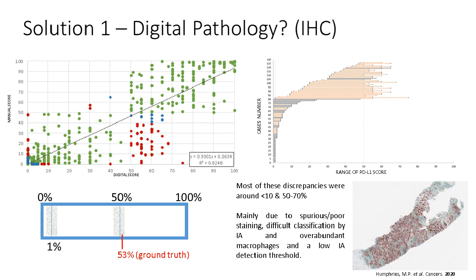Now, image analysis, or you or me or another pathologist could come along and say, well, actually, I think this is 97%. It's still correct. It's in the same clinical category, and the patient would have no adverse effects. However, if the program or you or I or another pathologist said, well, actually, I think this is 49%, it's actually closer in percentile points, but it's in a different clinical category. And so technically it's incorrect according to the first assessor.